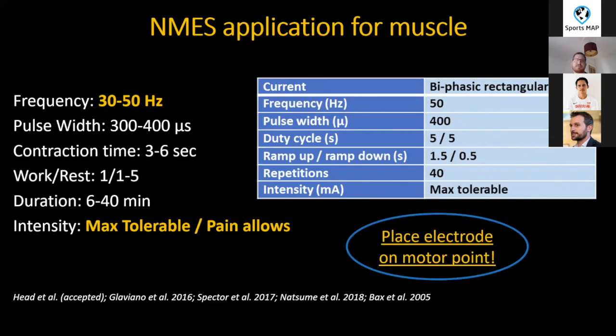Duration of 6 to 40 minutes. I use 20 minutes, and I do 2 lots of 20-minute sessions. And the intensity I use is max tolerable. The key point again is you want to be finding the motor points in the muscle. I also found out that my first paper from my PhD got accepted yesterday, which I'm delighted with. So this will hopefully be available soon.